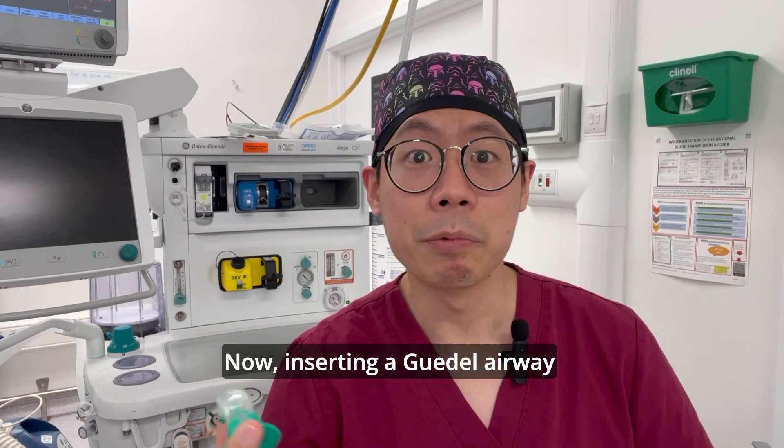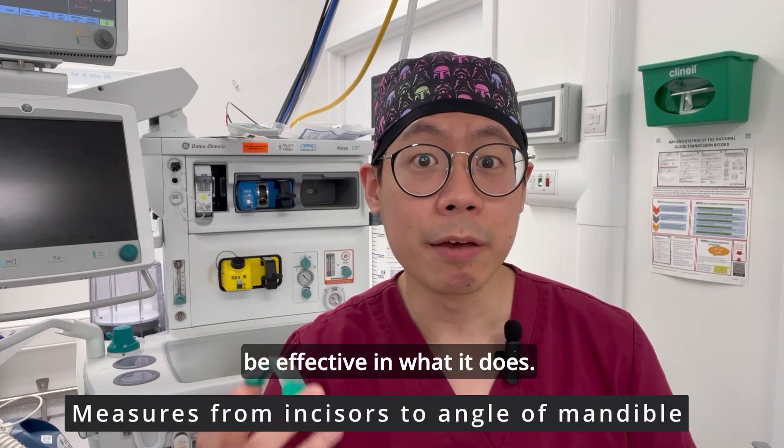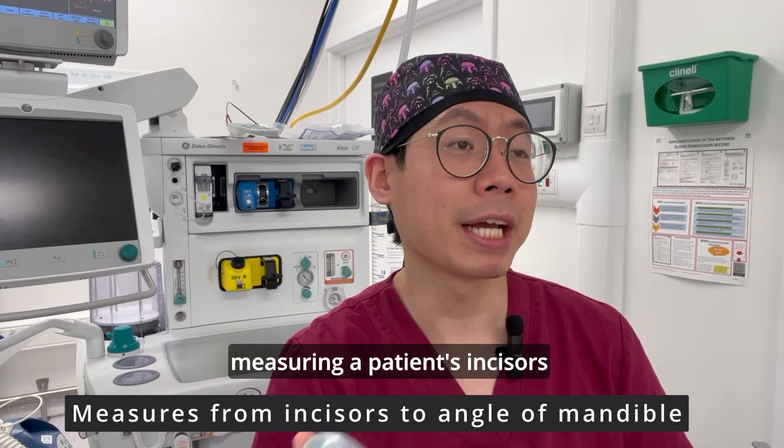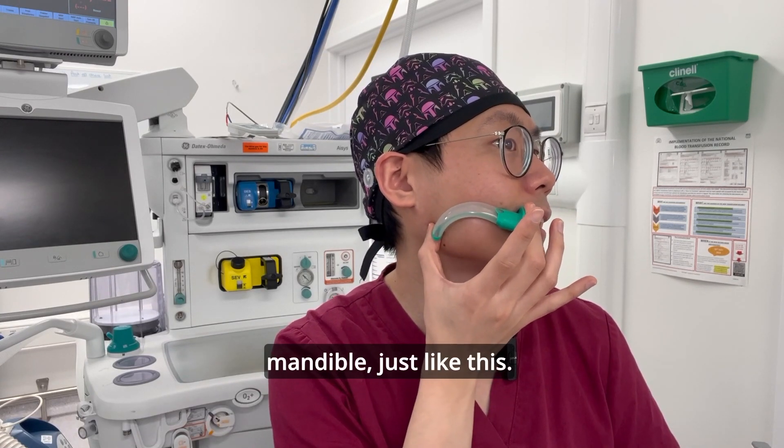Now inserting a Guedel airway requires skill and training — it must be properly sized to be effective. One way to size it is by measuring from a patient's incisors all the way down to the angle of the mandible, just like this.